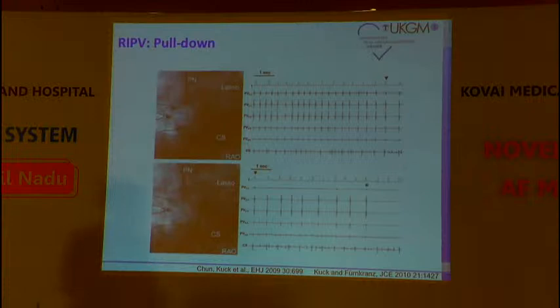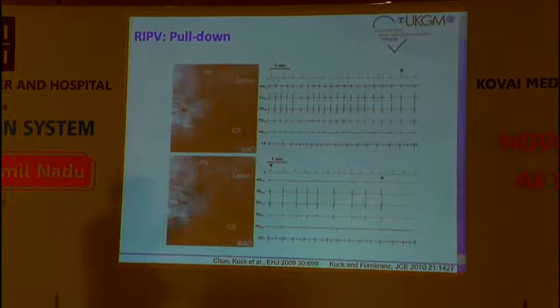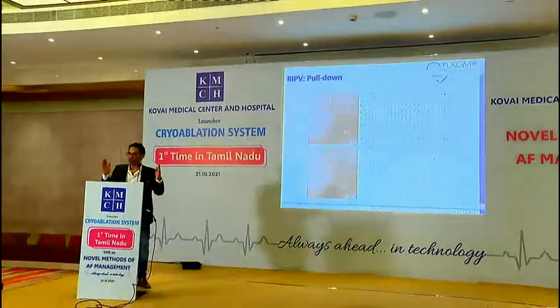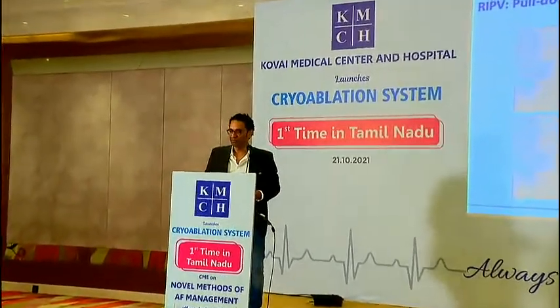You can see it only with MRI. If you want, you can see it only with MRI. Or you have to do a remap. You can remap the ostium, and once you see scarring around the ostium, then you're sure that you have transmurality. But if the patient has no more symptoms and no AF, then the question is, you know what I mean?